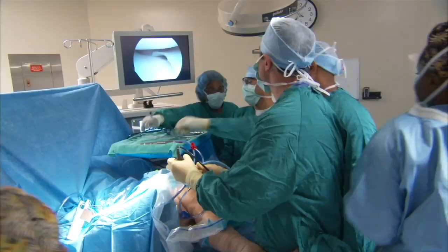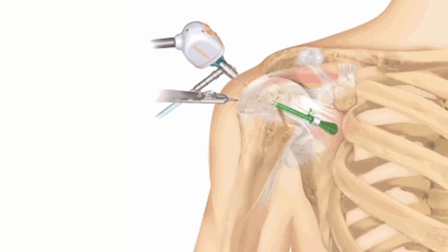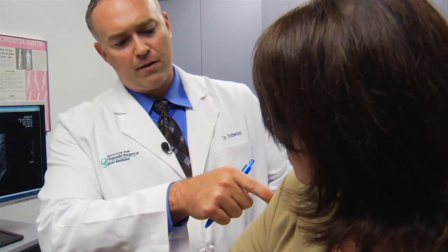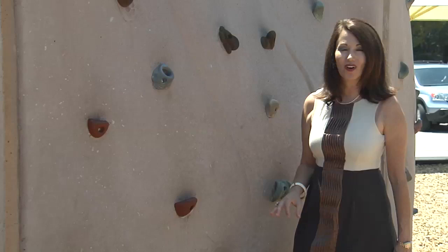Surgery is performed through a few small holes. We can do most of these surgeries through about three or four poke holes in your shoulder — one from the side, one in the back, one in the front, and then one on the side, and possibly an additional fourth portal, as we call them, through here.